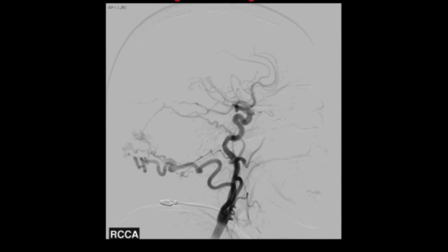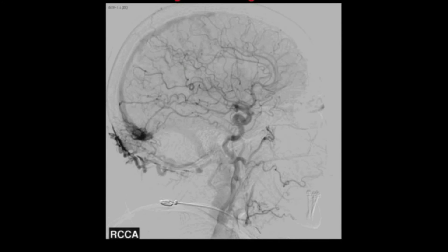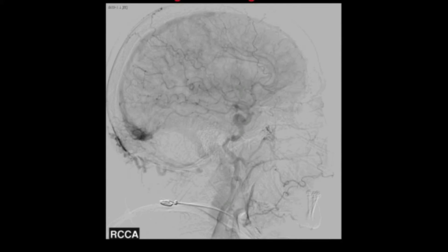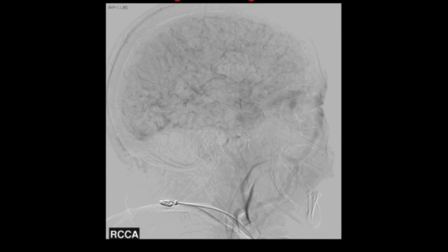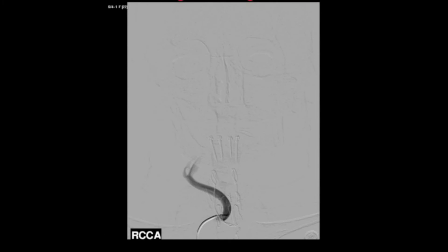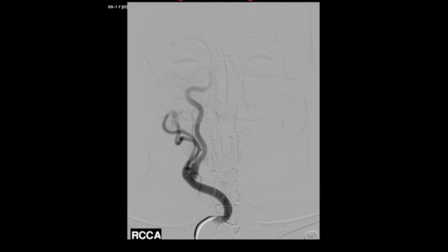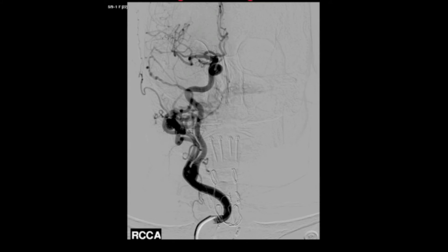Angiography of the right common carotid artery also demonstrates feeding vessels from both the internal and external carotid circulation. Because of this fistula's retrograde drainage directly into cortical veins, it is considered a type 3 fistula and carries a high rate of neurological deficit and hemorrhage.